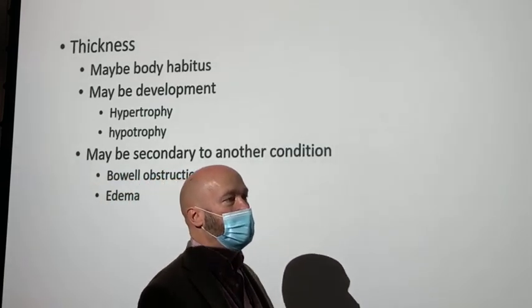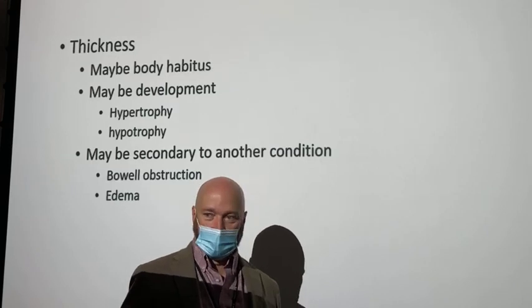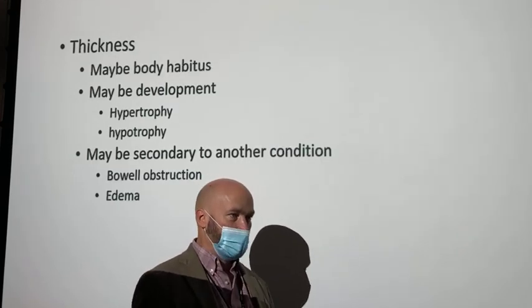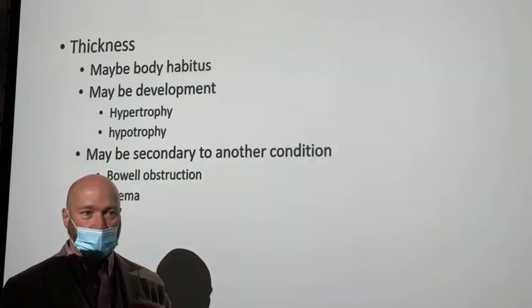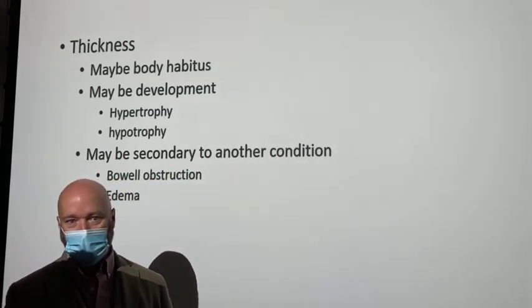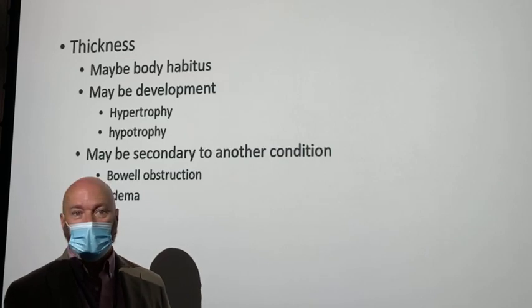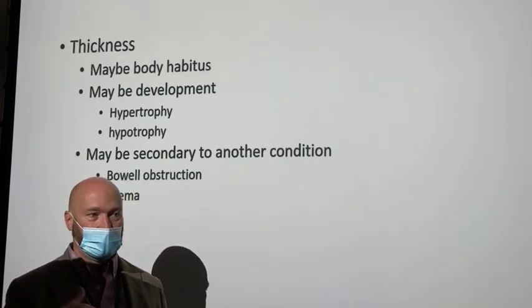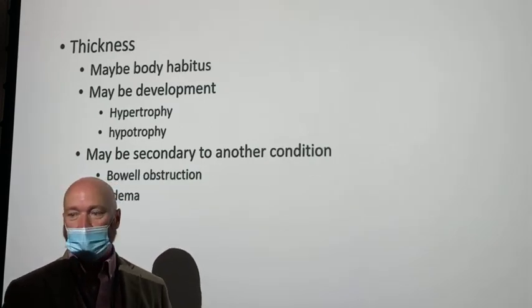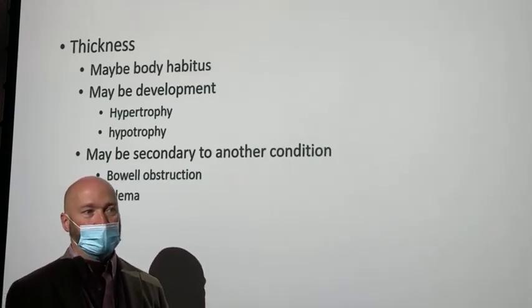The implication there is that they probably put a central line into the patient. So now you've got to ask questions. Are we shooting this for the central line? Are we concerned about a pneumothorax? How difficult was the stick? Because if it just slid right in, the patient's fine. You're looking truly for central line placement.